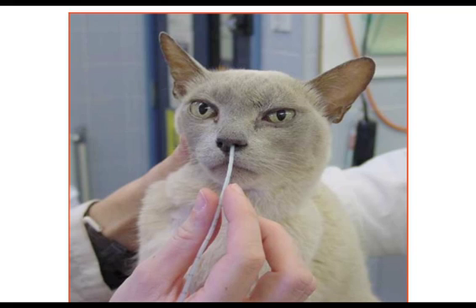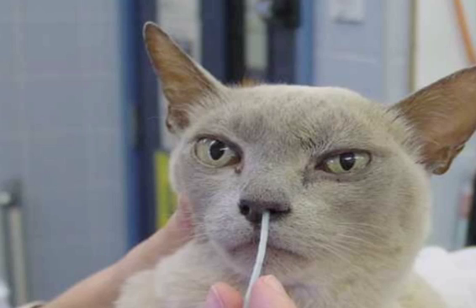So we're going to get this tube in this cat. Make sure when you're applying the tube not to have your finger too far back — don't have too much floppy tube sticking out — because you need just the end of the tube into the nose. We're going to aim it ventromedially. In fact, this picture I would criticise: I look as though I'm aiming it a little bit too far dorsally. So we really want to go ventromedially, and that's going to get us right down through the back of the nose and where we want to be.